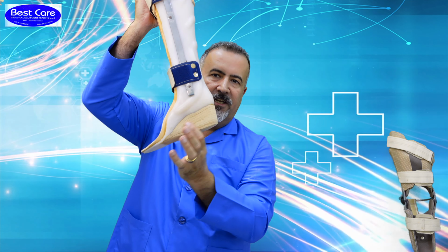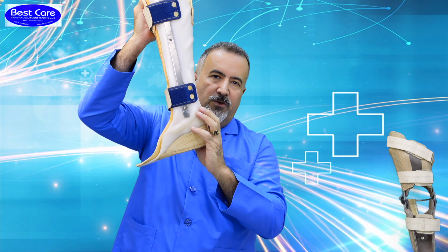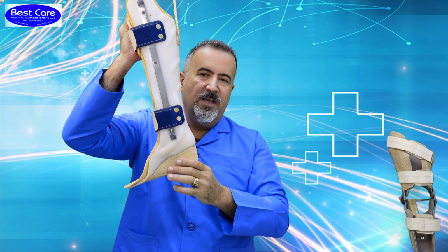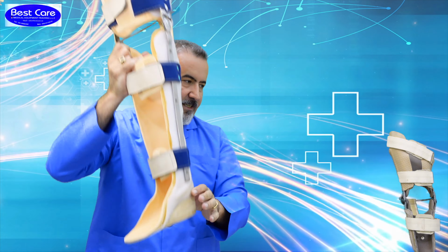In here, the ankle joint is fixed and there is no joint. Actually, we have used this because we want it to be more stable, and the stability for the patient is very important in this case.